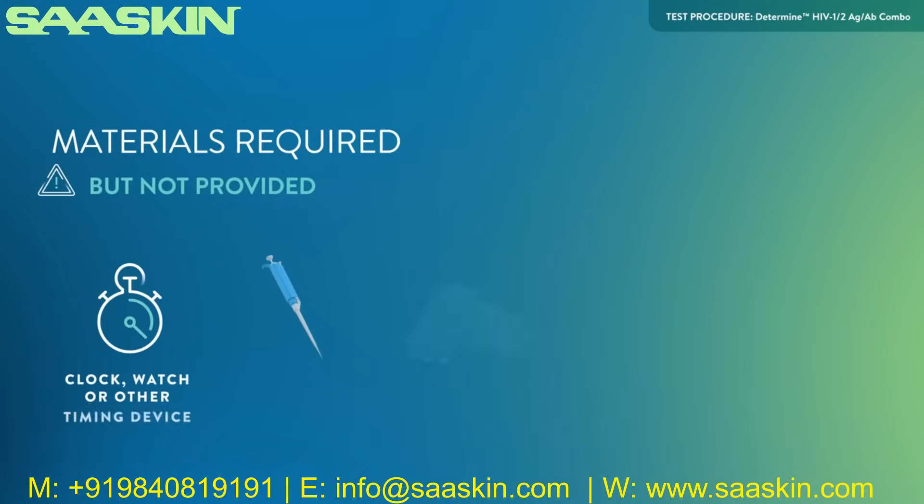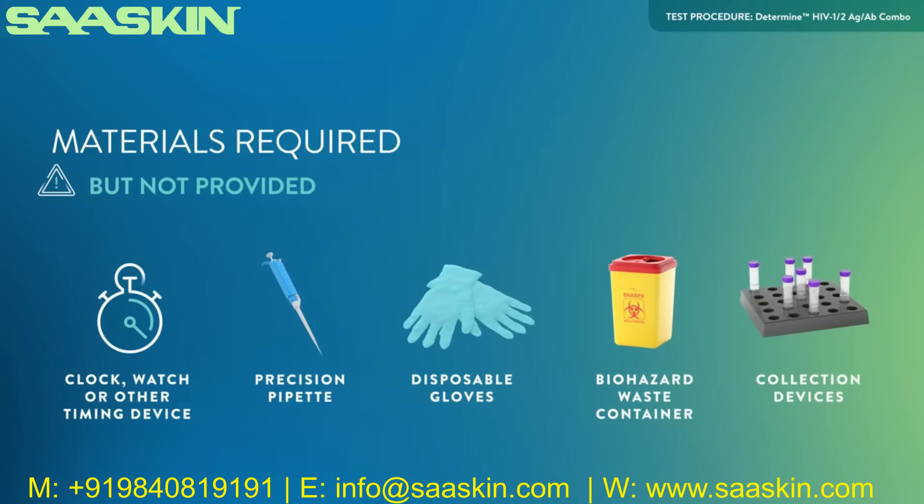Materials required but not provided. To perform the test with a venous whole blood specimen, you will need a clock, watch, or other timing device, and a precision pipette capable of delivering 50 microliters of sample with disposable tips, to be used in lieu of the disposable capillary tubes supplied with the kit. Additionally, you will need disposable gloves, a biohazard waste container, and collection devices.